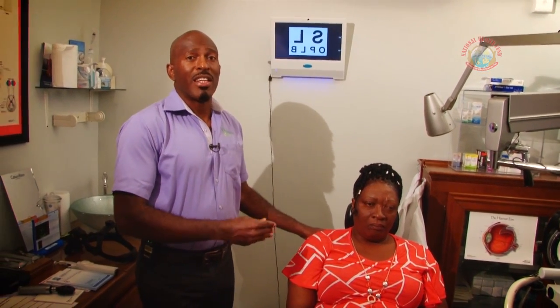Patient, and I think that expectation is best demonstrated. And so the patient will be seated in a chair. Usually we have other equipment around. Prior to the patient coming to the chair, certainly I advocate checking the blood sugar level, the blood pressure level, and certainly the eye pressure as well, the intraocular pressure.